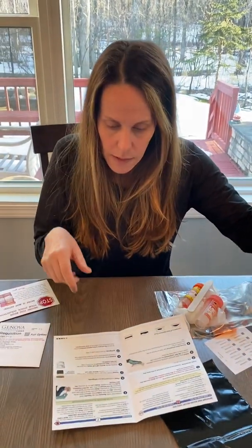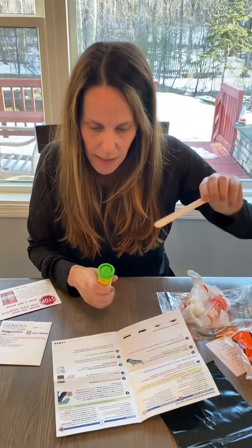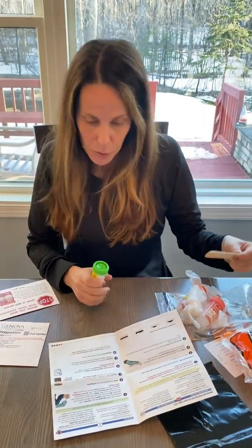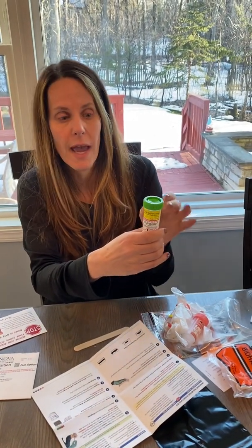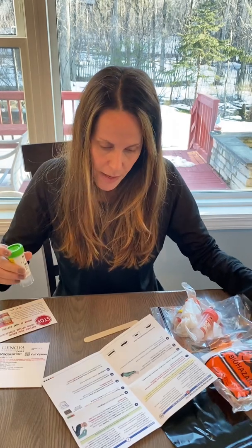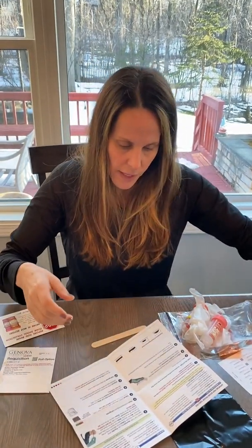Now we move on to step 5. There is a green tube, okay? You remove the cap and you take with this stick some of the stool, you'll have your gloves on, into this, and you collect from different areas of the poop. So all over, take little samples, and then you put some in here up to this fill line, which is the red, and then you shake it up, okay? Don't overfill it, screw back on the top, and then shake it for 30 seconds and do not freeze, okay? Then you put it back in the bag that you took it out of and put it in the refrigerator, and it says refrigerate. Okay, so that's that one.